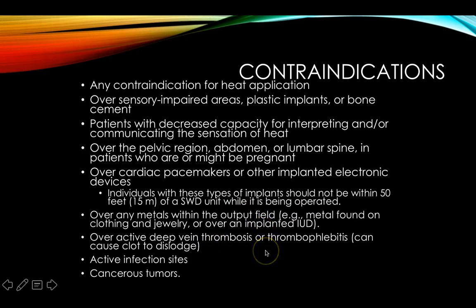Over any active deep vein thrombosis or thrombophlebitis, that could cause the clot to dislodge, and we don't want to do that. Active infection sites, again, just like our other heating, we don't want to stimulate the infection and the cells, as well as same with cancerous tumors. We wouldn't want to do that. If someone has a fever, we wouldn't want to use diathermy, really any of our heating with anyone with a fever.